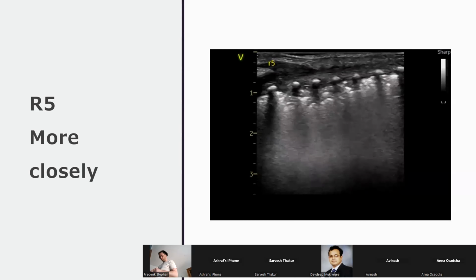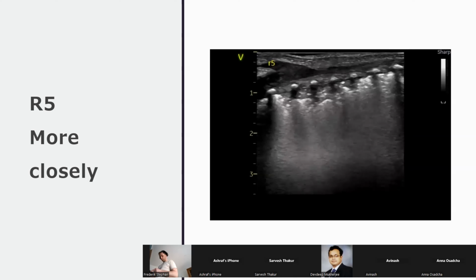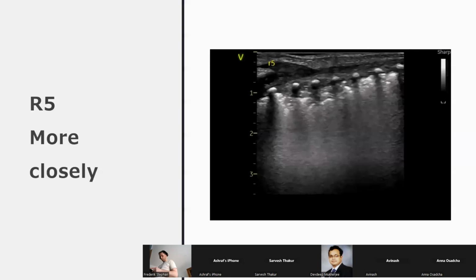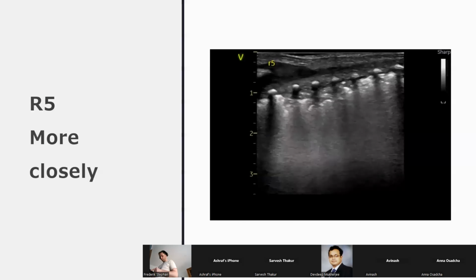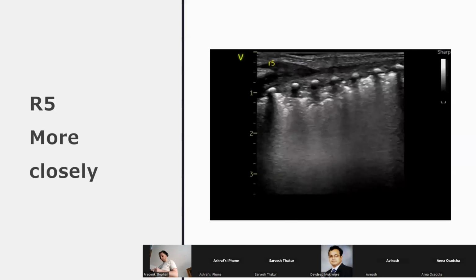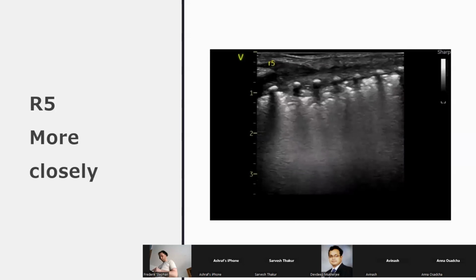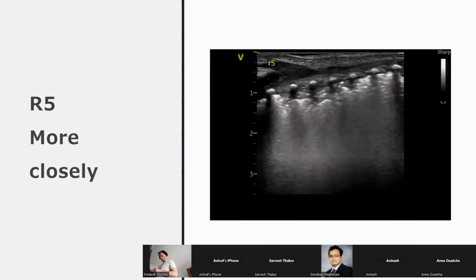There should be serial follow-up in a short time to be safe. Yeah. Now the challenge again is holding the probe there for 10 minutes. That's a long, long time. Sometimes the nurses think you're crazy, especially in the UK, where they wonder what the hell is happening. It's worth explaining to them before you start the length of time you're going to take. More importantly, make sure somebody is keeping an eye on the baby hemodynamically, SATs, heart rate, all of those things, because while you're scanning and looking at the image, nobody is watching those observations.